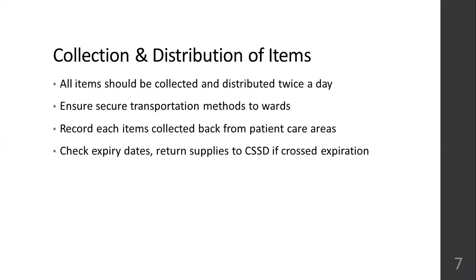Okay, check expiry dates. This has to be done in the wards. When you get the CSSD supply, everything comes with an expiry date. Okay, so on a daily basis, a checklist has to be done for expired CSSD items, and if the packs have crossed the expiration date, they have to be returned to the CSSD.